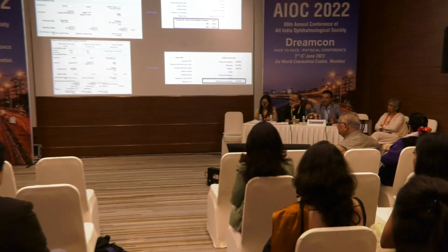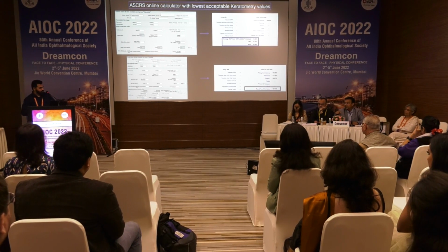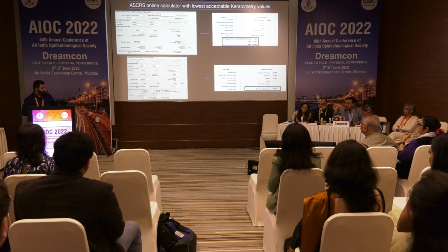But if any of the formulas were taking these values, wouldn't the ASCRS calculator also have calculated it by some formula? I'm intrigued because your sheet does not show Pentacam inputs. You're putting it in the topography inputs where it will not take it. Can you see your maps? I mean, you don't have the Pentacam inputs available anyway.